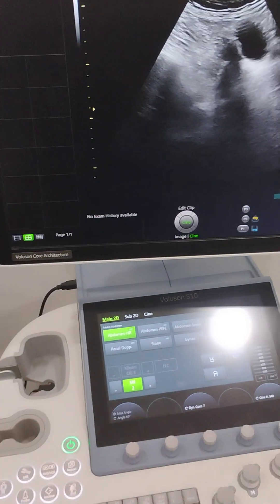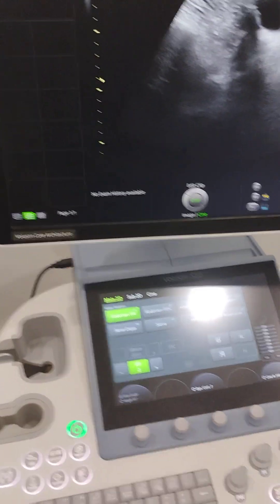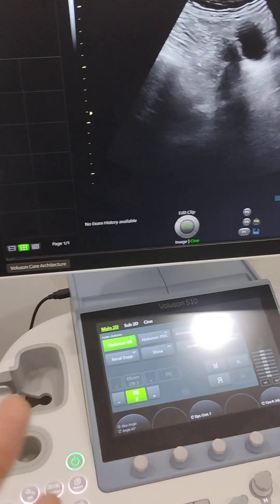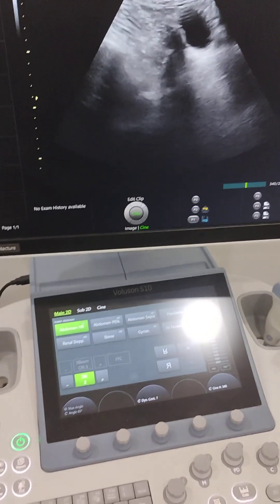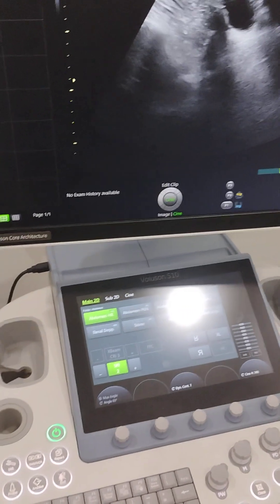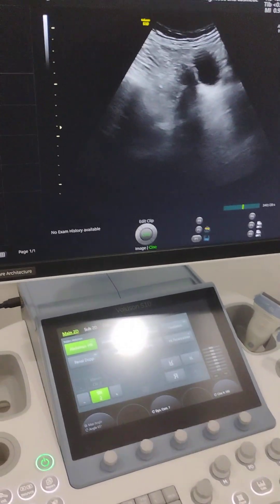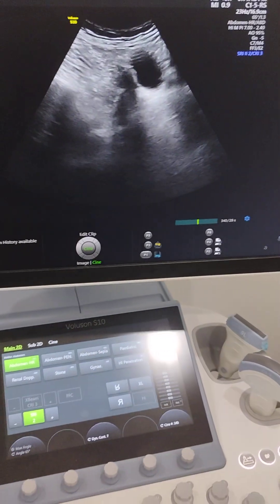All the red tapism and formalities — you will have to take the permission first. Do not just move the machine from here to there, because that is going to involve a lot of formal responsibilities that are going to be fulfilled by the person who is moving the machine, whether that is the doctor or the staff.